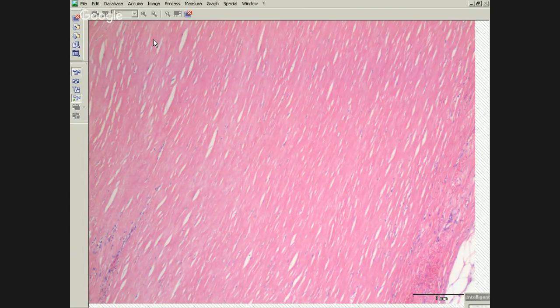So I want you to get this burned in your mind, so when we look at some cases down the road, you can tell the difference, and we'll do a compare and contrast. That is basically we do not see any cellular area rather than the fibrosis. Okay, but what about the pattern of the fibrosis? It's like very bland, more collagenized. Okay, what direction is it growing in? Parallel. Parallel, right. So we have very linear deposition of the fibrosis.